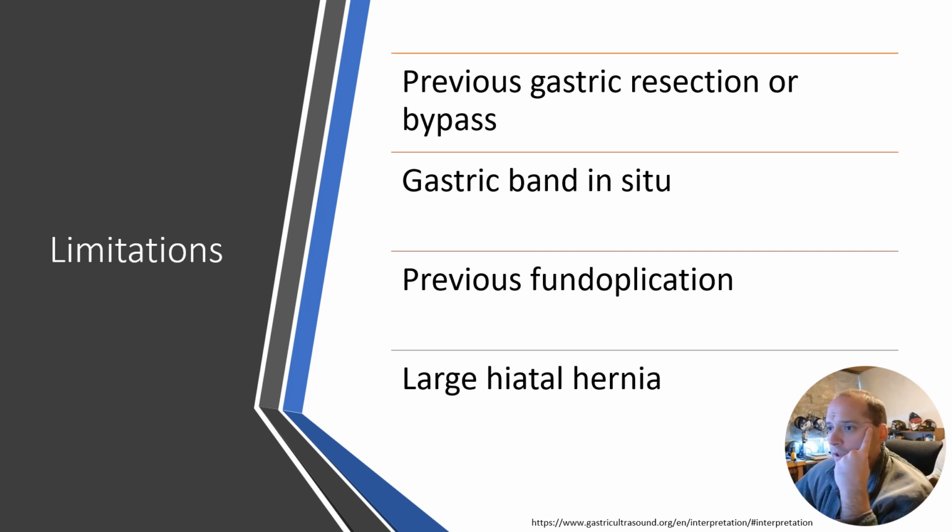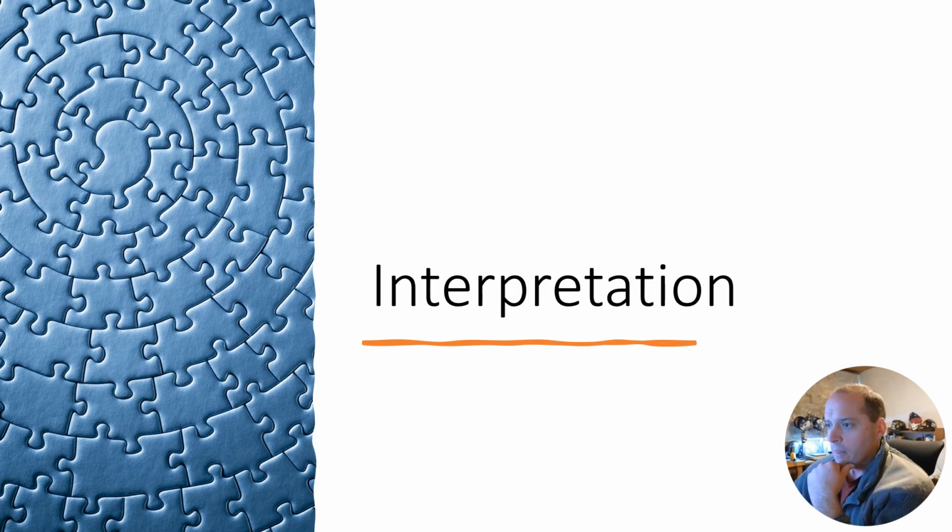So limitations: patients who've had gastric resection or bypasses, a gastric band in situ, fundoplications, or large hiatal hernias. In these patients it's not very reliable, so practice or advance with caution. And then how do we interpret this?